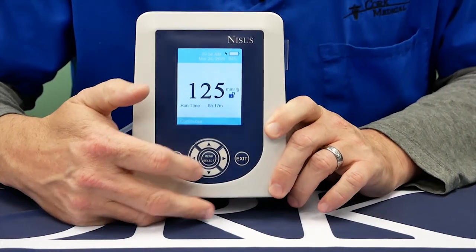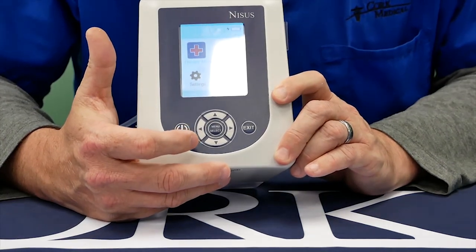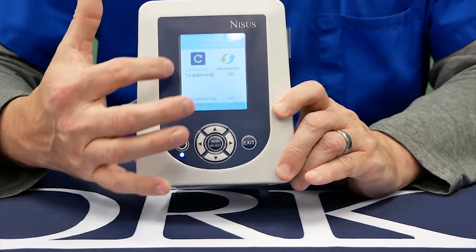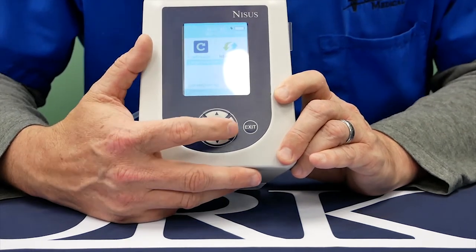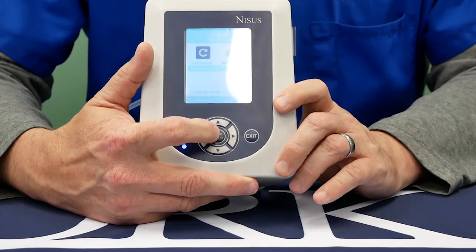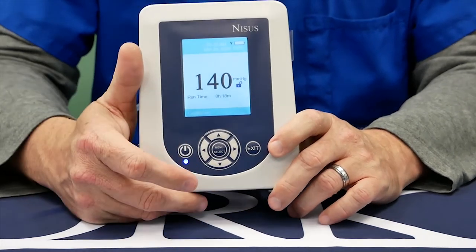To navigate through the device, you have the menu or exit button, which controls most of the device's functions. To operate the device, you press the menu button and four simple icons come up. The clinician may need to adjust from intermittent to continuous mode of therapy. In continuous mode, you can set the pressure from 40 millimeters of mercury up to 200 millimeters of mercury. Once you have the prescribed order, you hit menu or select and it says, do you want to accept changes? The new therapy is then displayed on the base menu.